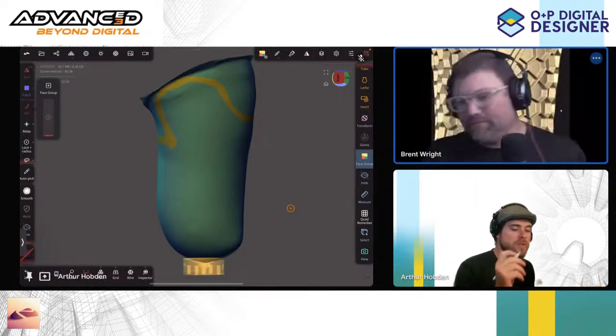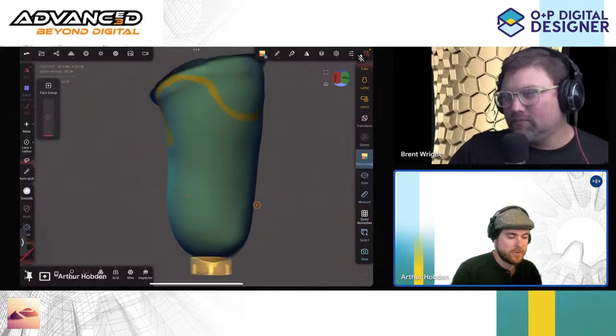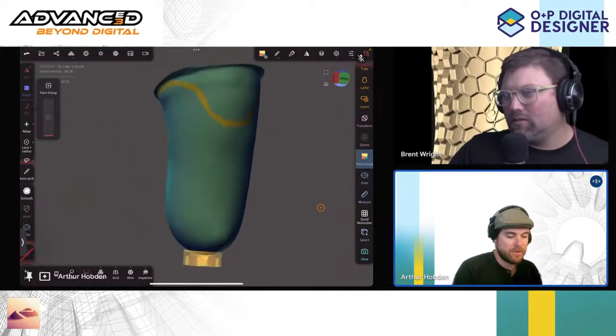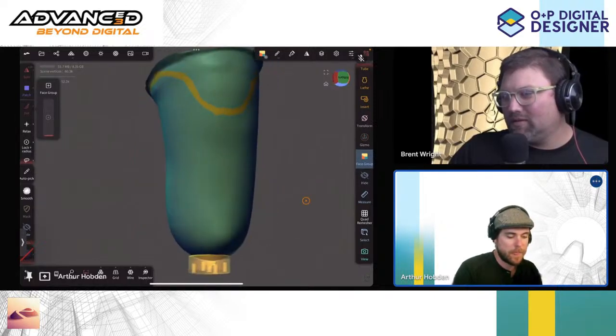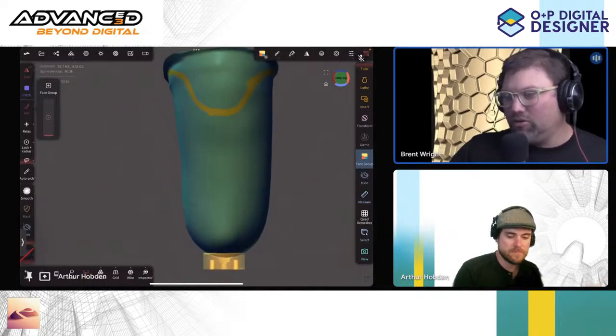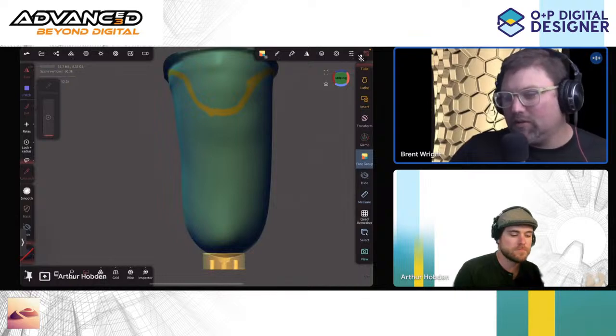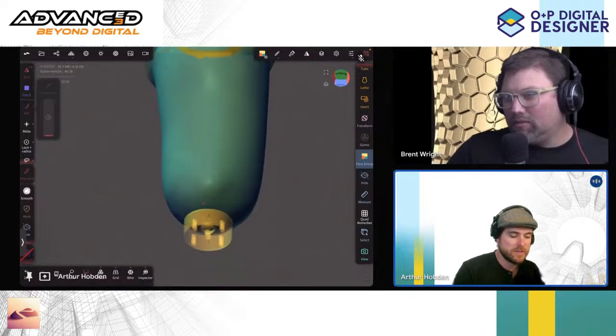Okay, awesome. Very cool. So to replicate that, am I going to be doing a band of saran wrap across the middle here to reduce it? For this one, it's a pretty prominent distal tibia, so you'll want to add material to that distal tibia. Okay, all right, we'll start there.